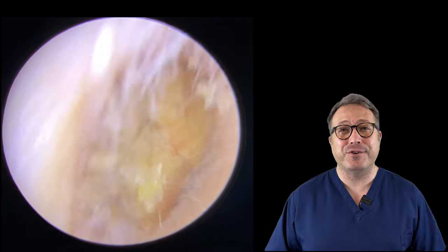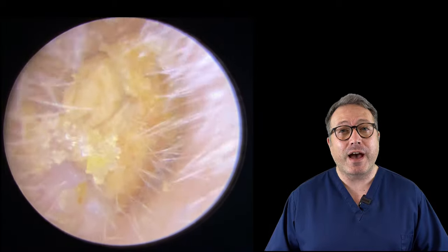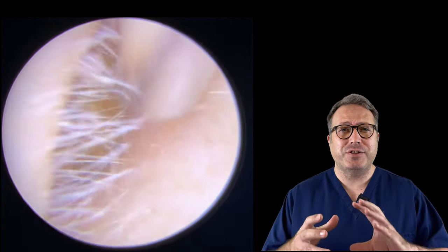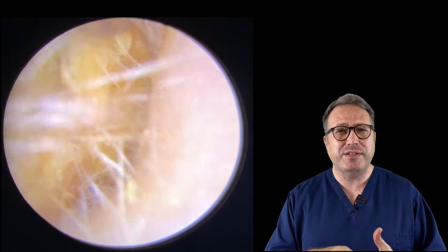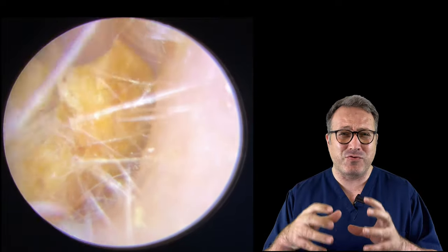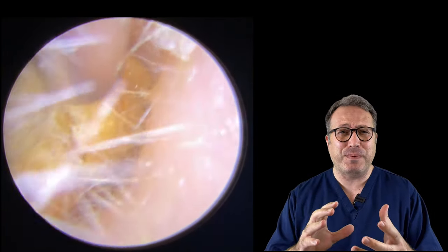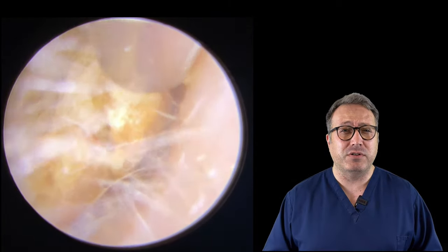Hi everybody, this is Rhys Barber from Audiology Associates. Thank you very much for watching our earwax removal video today. Just one patient in this video. What you can see here is the patient actually tried to remove their own earwax by pushing tissue paper into their ear, and they've actually managed to jam it in really, really tightly. So they've impacted the tissue paper and the wax together, giving us a really, really blocked up ear canal.